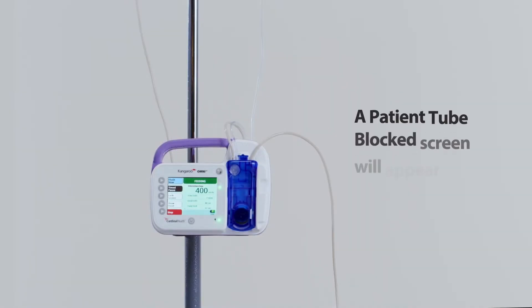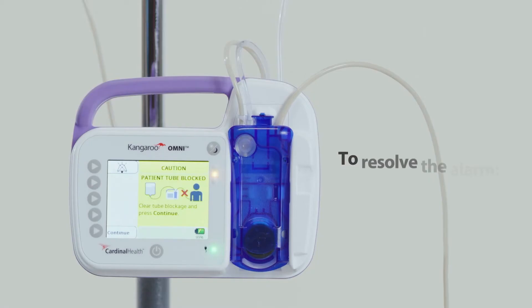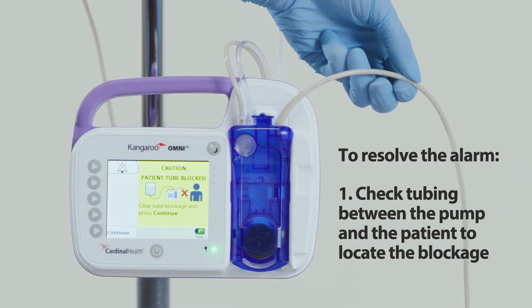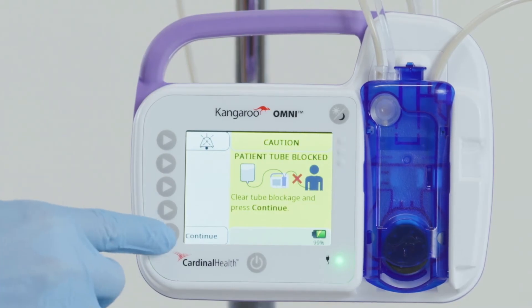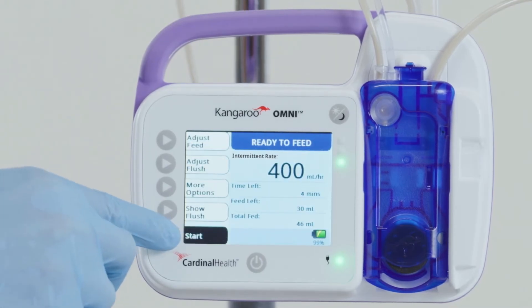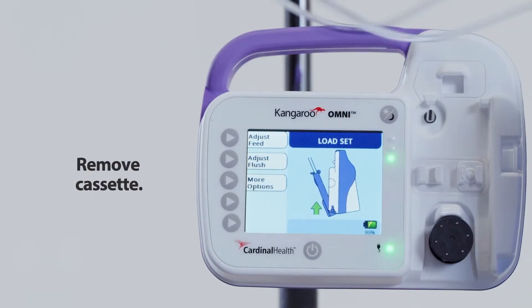Patient tube blocked alarm: a patient tube blocked screen will appear when enteral fluids are no longer being delivered because of a clog in the tubing between the Kangaroo Omni enteral feeding pump and the patient. To resolve the alarm, first check the tubing between the pump and the patient to locate the blockage. Second, if possible, clear the blockage. Third, once cleared, press continue. Fourth, restart feeding. If the alarm continues, remove the cassette from the pump.